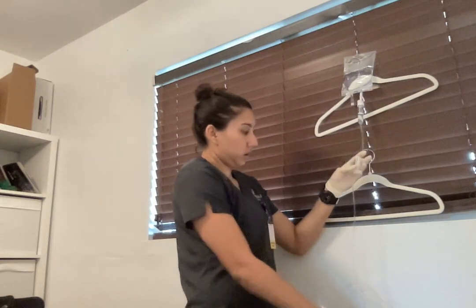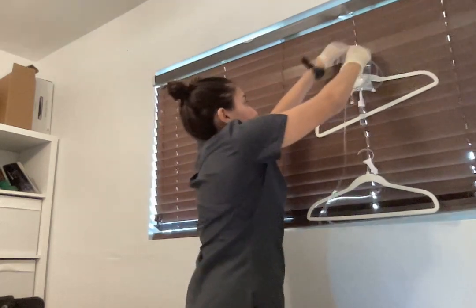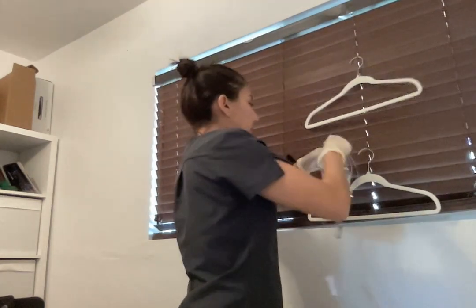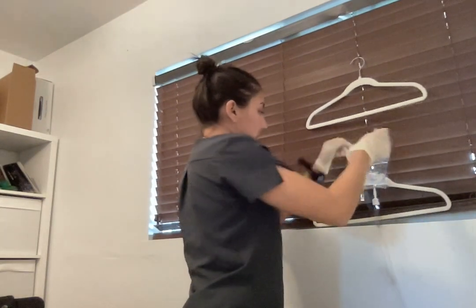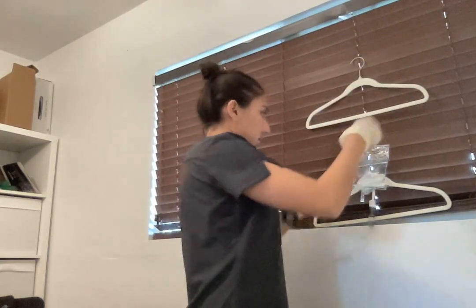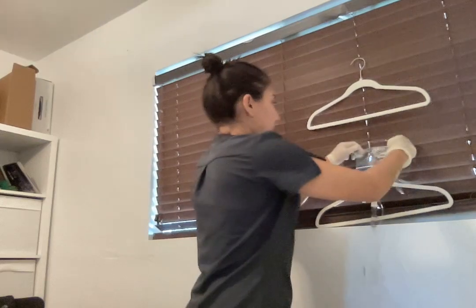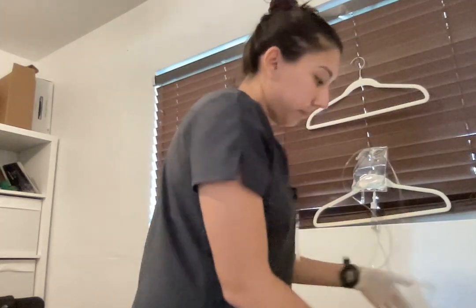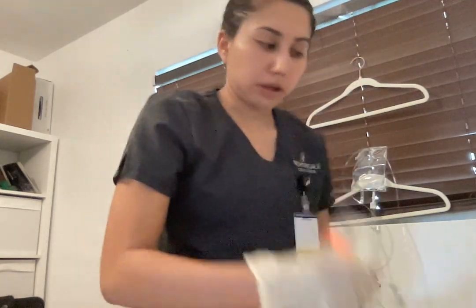Alrighty. So that has been a minute. For my secondary line, that will be the medication.